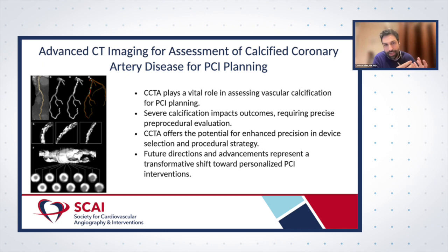Now in the paper, we take one step further than that, and introduce the possibility of CT to stratify calcium, not only based on the morphology, but also based on the density. And this is something that is unique for CT. In other words, the higher the density, the harder the calcium is.